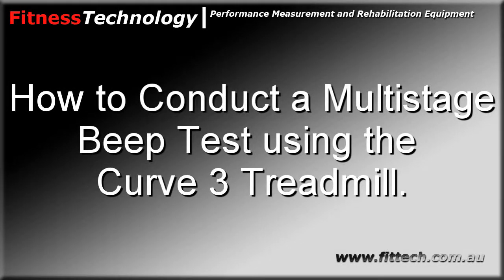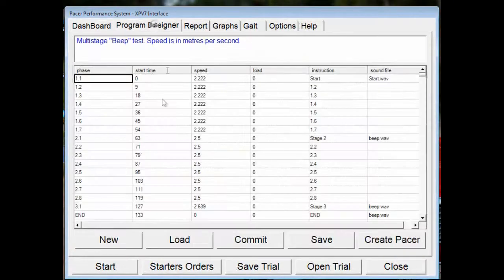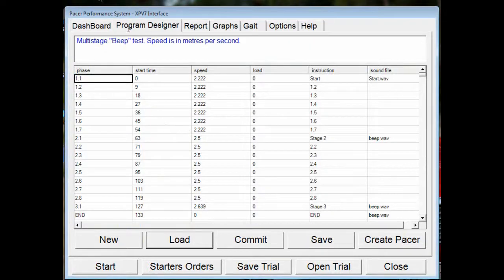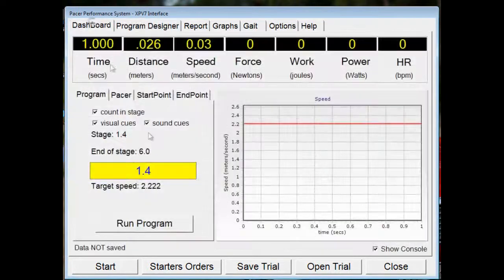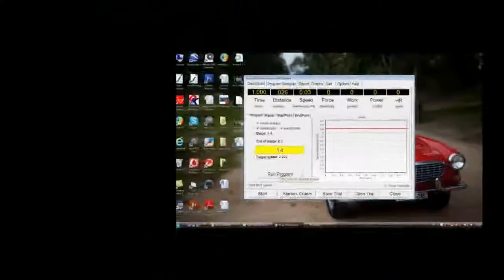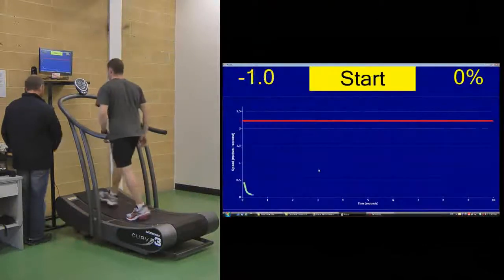This is an example of performing a beep test using the Curve3 Treadmill Program Designer. This program is available with the software. Basically, you go to Program Designer, Load, and choose Beep Test. Make sure visual cues and sound cues are checked, and click Run Program.